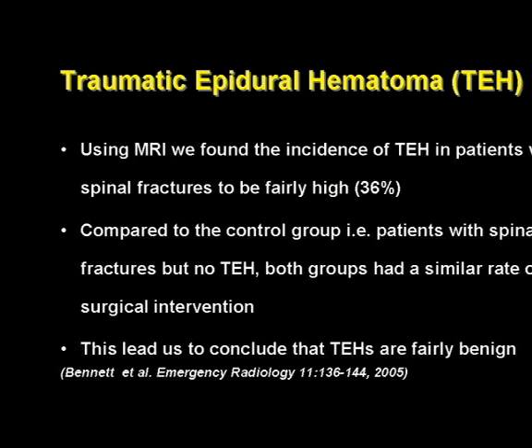Epidural hematomas, we see a lot of these, and we did a study on this. They're actually very common, and we were worried at the beginning, but when we did the control studies between people who have epidural hematomas from these injuries and people who have fractures but no epidural hematomas, both of them had the same rate of going to surgical intervention. So we concluded that we report them, but we don't think they are a big deal.